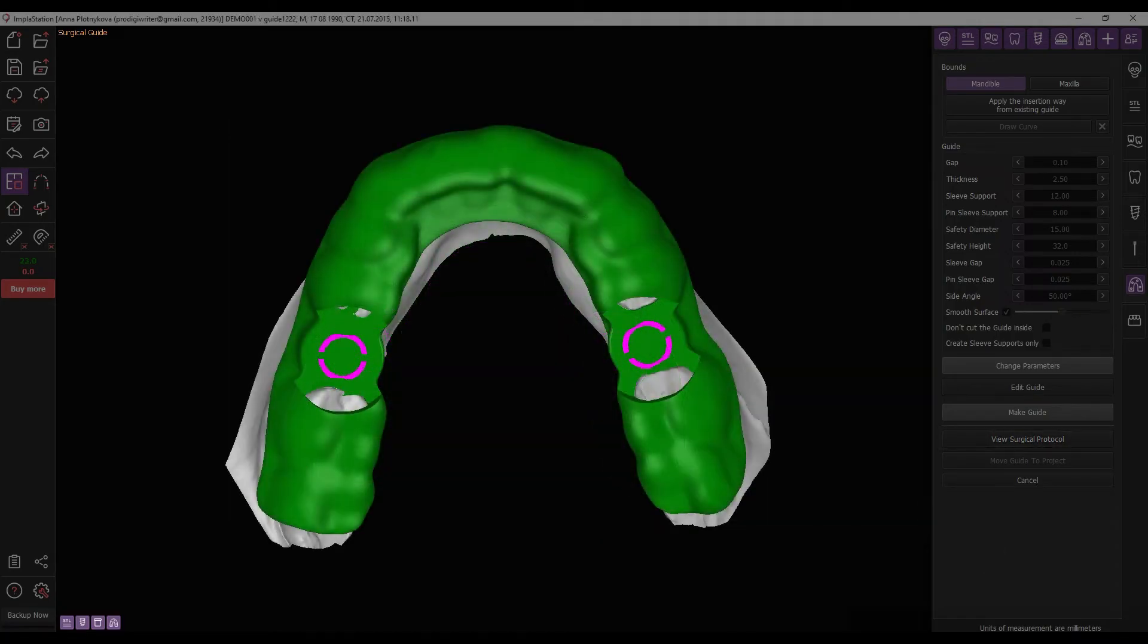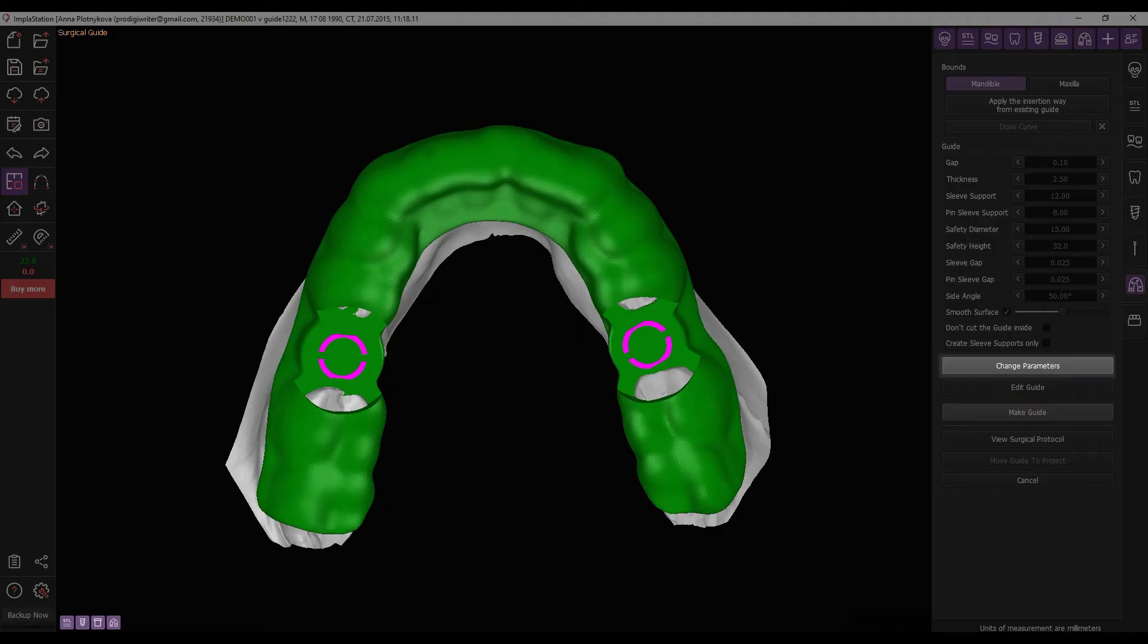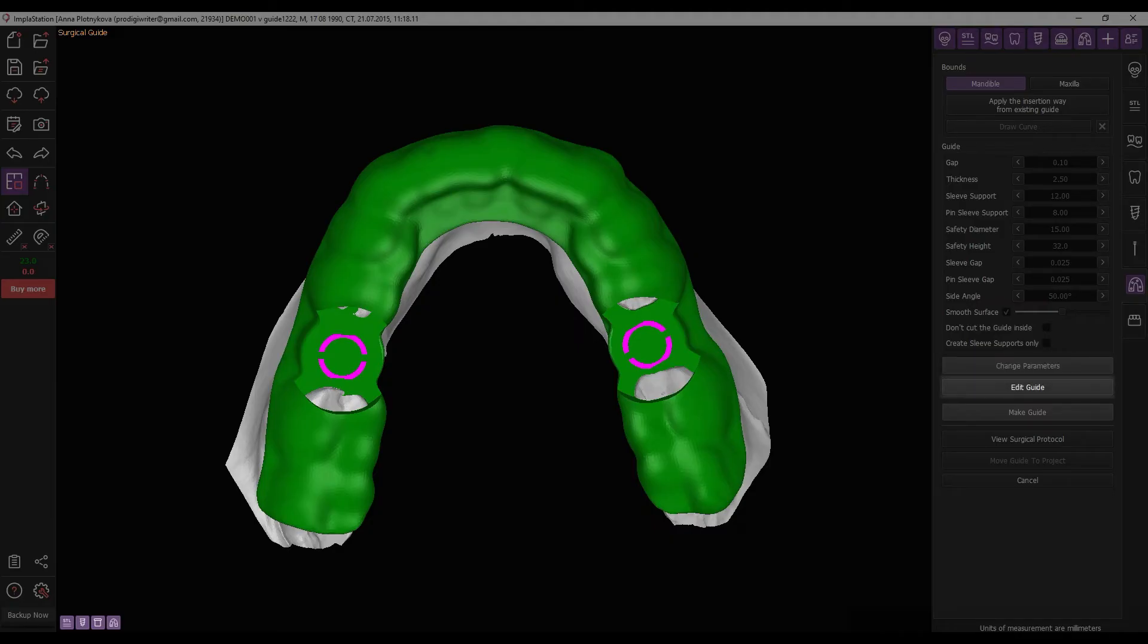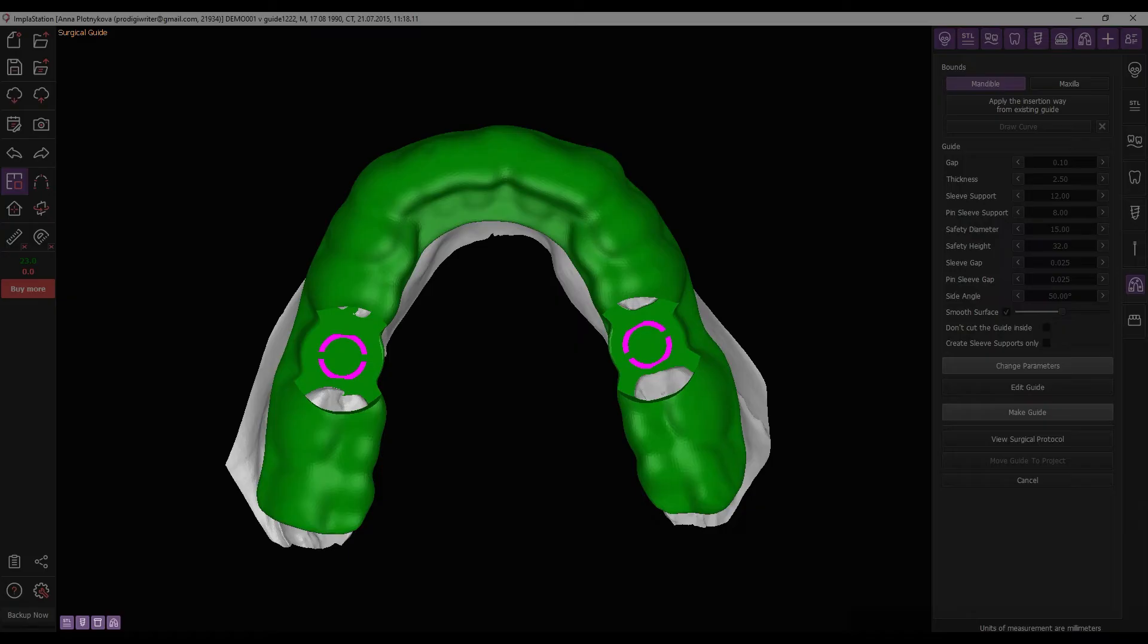After reviewing the guide draft, the next step could be as follows. If the result is unsatisfactory, use the Change Parameters button to return to the previous stage and adjust the guide's shape and settings. If the guide's result is acceptable but requires additional modifications, proceed to editing by clicking the Edit button. If the guide is ready, complete its creation with the Make Guide button.